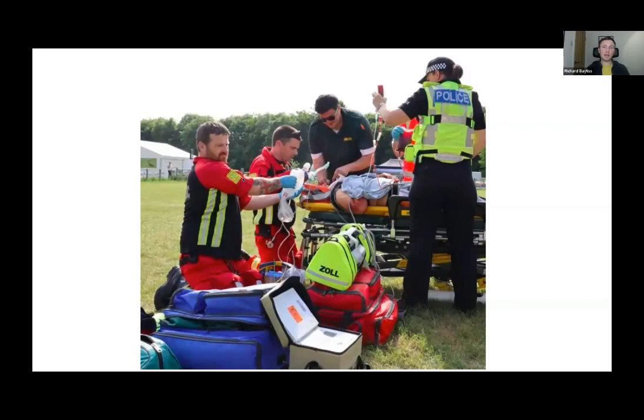The only risk of that approach, as you can see one of my colleagues demonstrating really well here, is that one of the roles of the airway assistant is to provide global situational awareness of what's going on. As you can see here, Chris has his eyes firmly focused on the monitor, and he'll also be aware of what the other people on scene are doing. Whereas Alan, who's just performed the intubation, will very much be task focused on that. And the risk is that you then get the whole anaesthetic team being task focused rather than just the intubator.